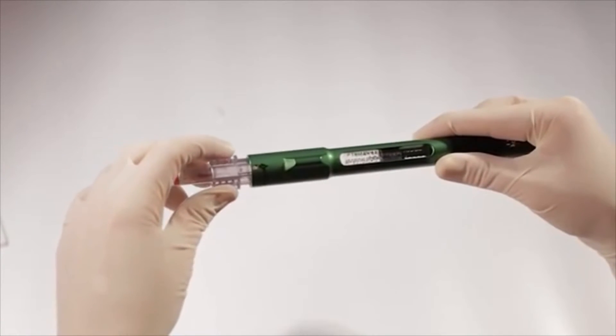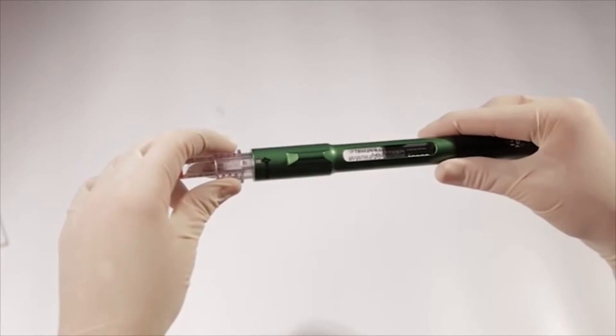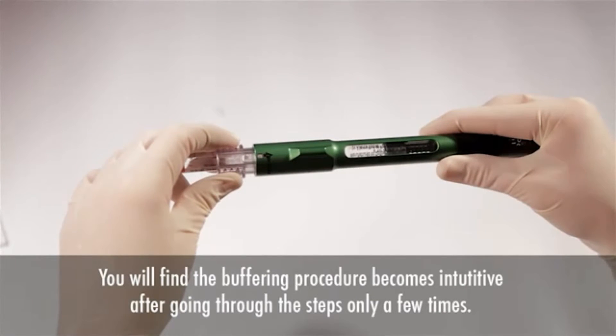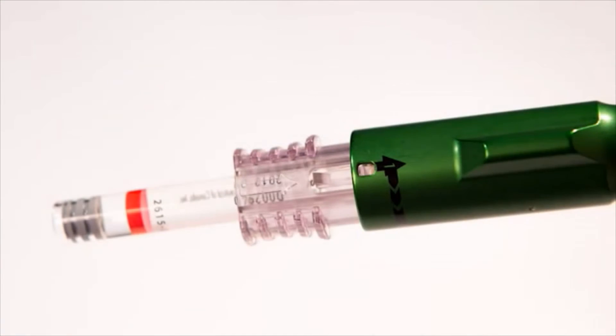When fully seated, you can't see the metal cap on the cartridge as you look at the connector from the side. Practice with the cartridge two or three times to get the feel for this — you'll find that it becomes intuitive after a few repetitions. Also, to prevent the problem with the plunger coming out during mixing, be sure that you always load the 1.8-milliliter cartridge in the number one position.